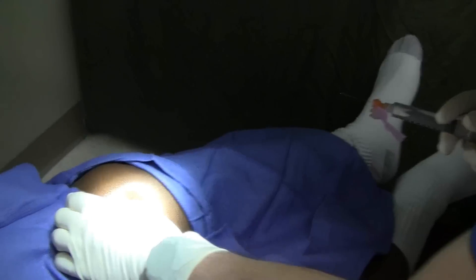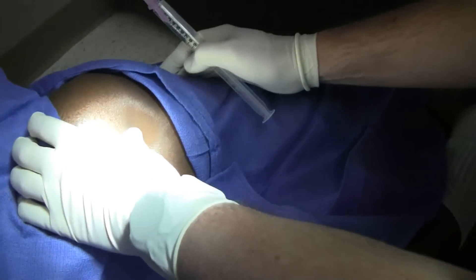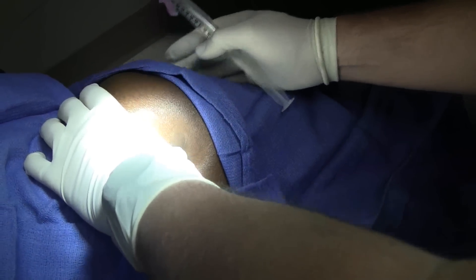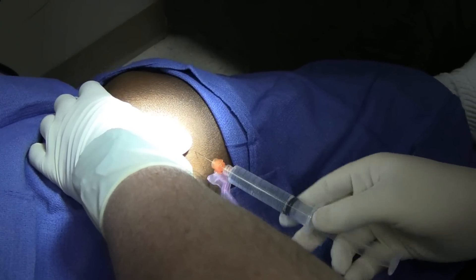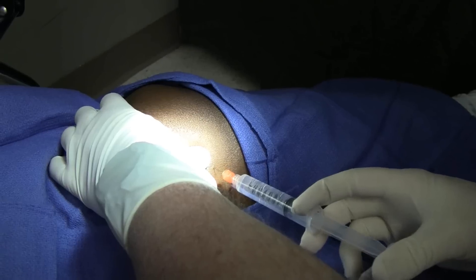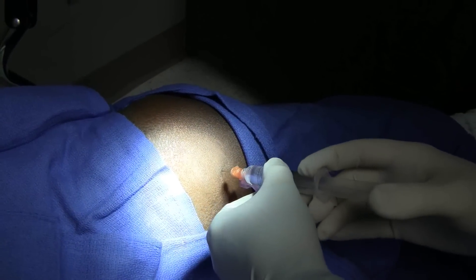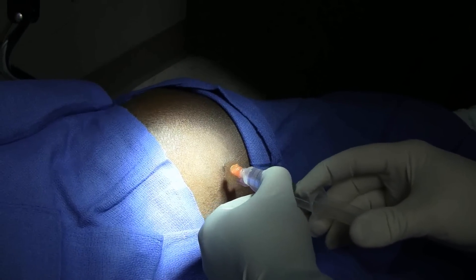It feels really ballgame-y but I think my space is going to be right about here. There it is — that's going to be my target zone. You're going to feel a little pinch, sir. I'm going to fan it out because I want you to be really numb — as numb as I can get you. Since I'm moving fast, I don't always aspirate.